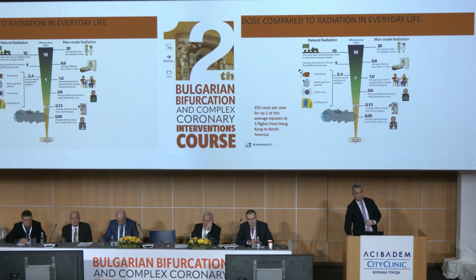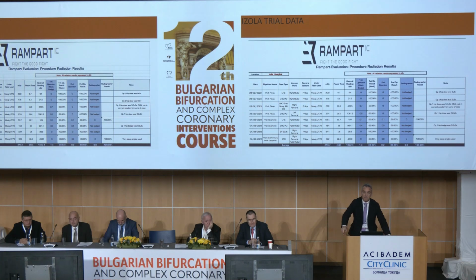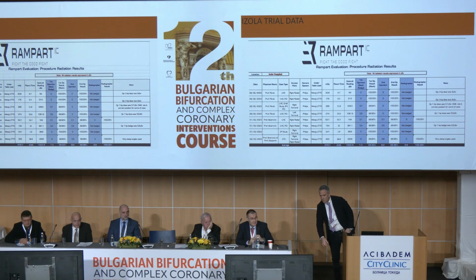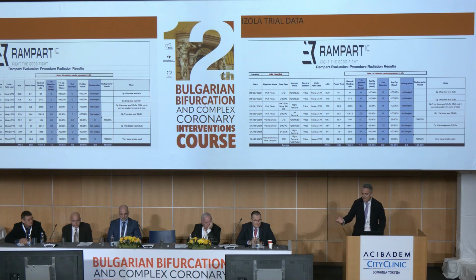So this is how Rampart basically gets us protected. This is the dose that we got from Rampart when we tested it last year. And so you can see here, it's really small. The doses were really, really high, and the protection was like 99.8%. There were some really tight and really long procedures.